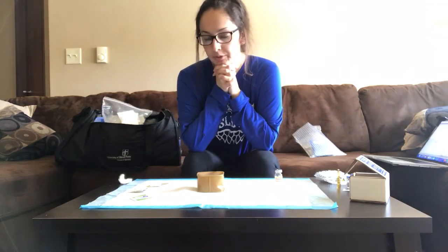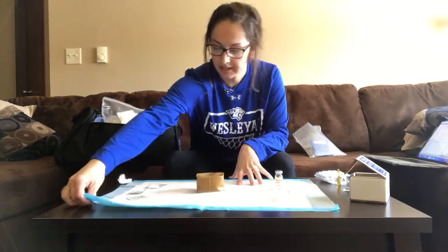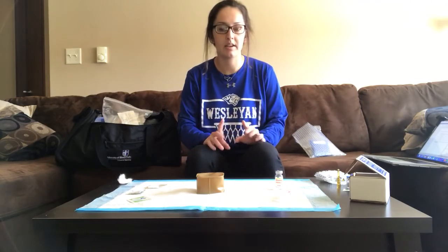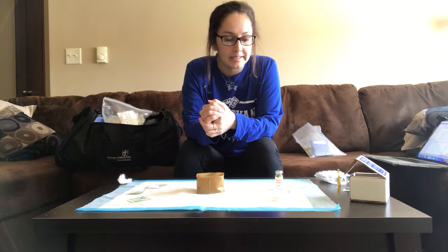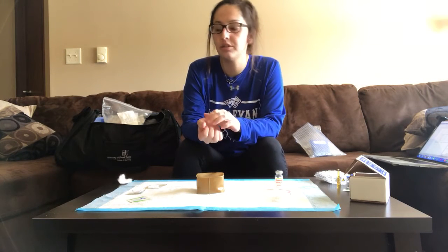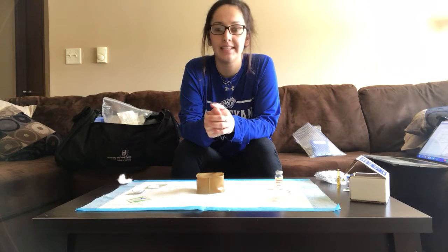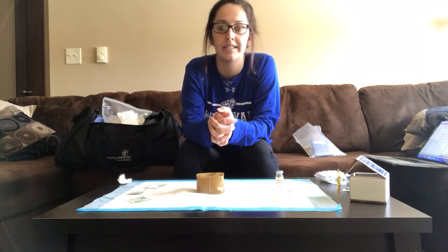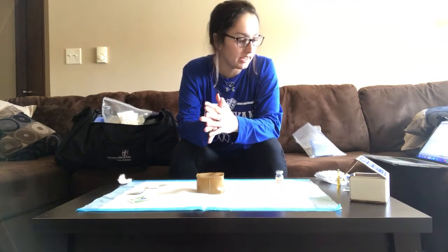Okay, so before I get started, I'm going to check the electronic records and make sure I get the right medicine and that I'm dealing with the right patient, you know, the 10 rights. Then I'm going to enter the patient's room, introduce myself, provide privacy to the patient, and identify the patient using 2 forms of identification. I'm going to double check the dose again. I'm going to double check the MAR again.